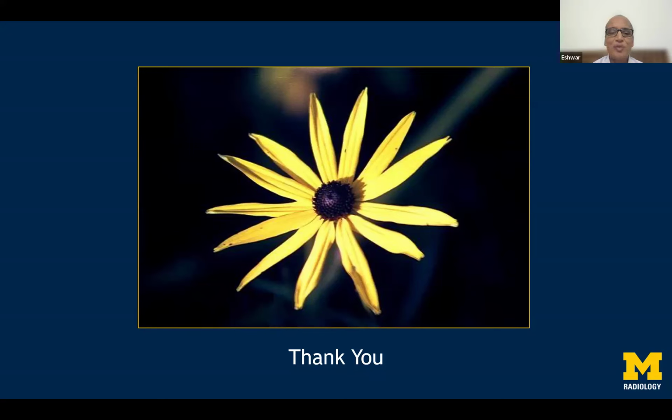Any other questions or comments? Yeah, this is Dr. Kishore. Sir, your presentation was excellent. Paranasal sinus is also my favorite topic, but I learned a few new things from you. Thank you very much.